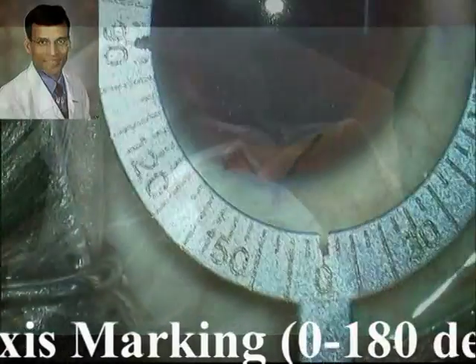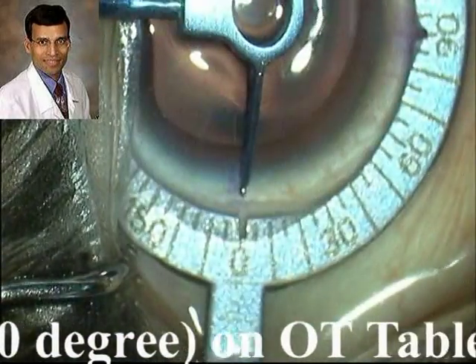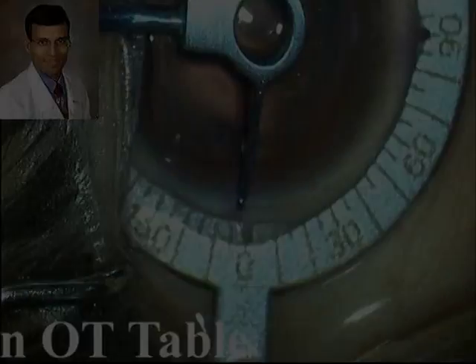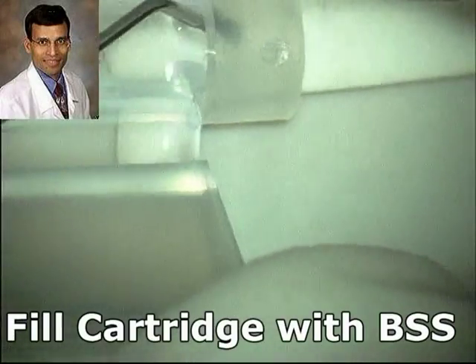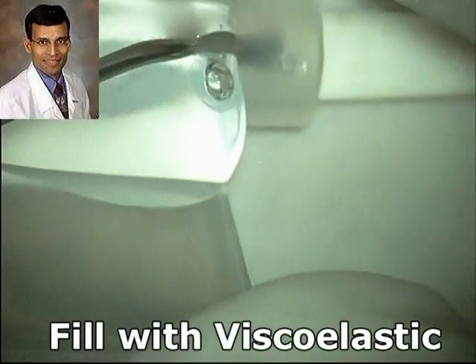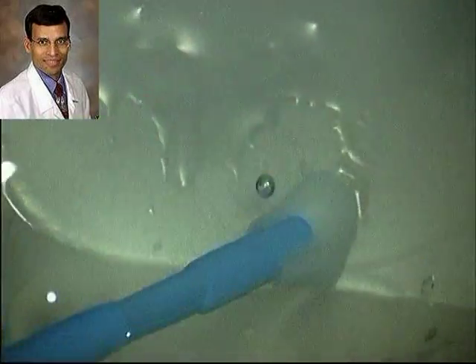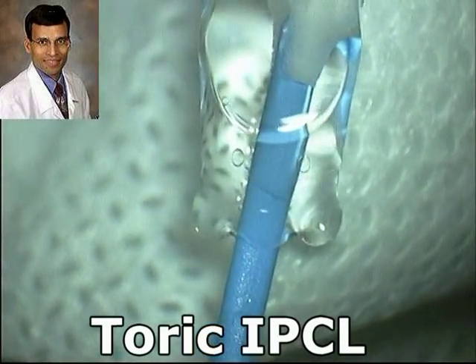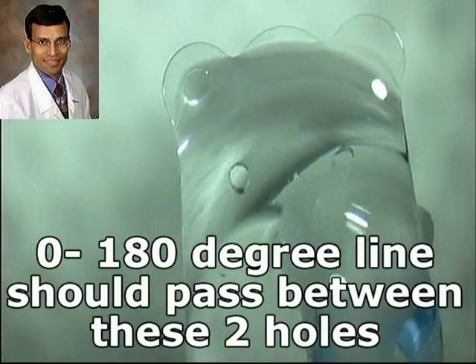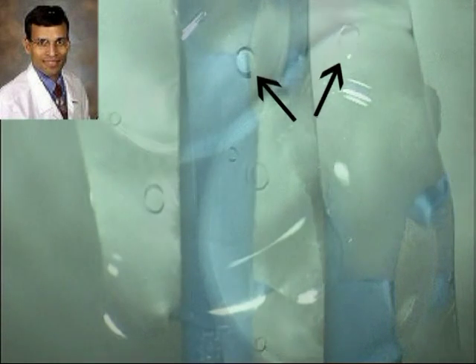A drop of topical anesthetic is used and the axis marker is placed on the cornea and the axis is marked. Once we take the patient into the operating theatre and place them under the microscope, we again mark the axis under the microscope. We open the IPCL and fill the cartridge with BSS and HPMC. The toric IPCL is designed so that the 0 to 180 degree axis line should pass between the two holes placed on the haptic, which have been marked here with arrows.